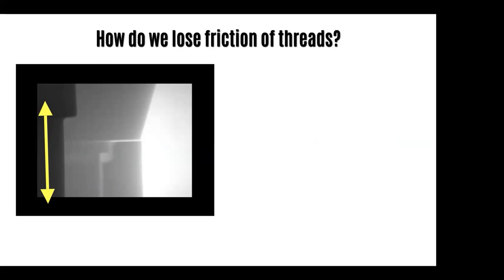Increase or decrease? It'll probably increase. The friction will be even bigger. So is it possible for the screw to rotate counterclockwise at this time? Probably not. The screw just won't get loosened because it's in greater tensile force or clamping force.